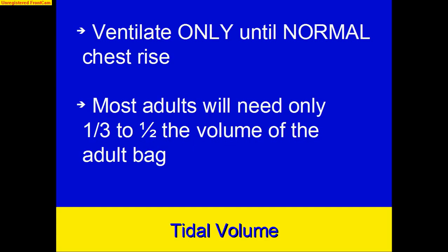In years past, we have ventilated too rapidly, too often, and definitely we've overventilated in terms of volume. These are the new standards. American Heart supports this. The current industry literature is full of this sort of stuff, and we really need to focus on making the switch to proper volume and proper rate.